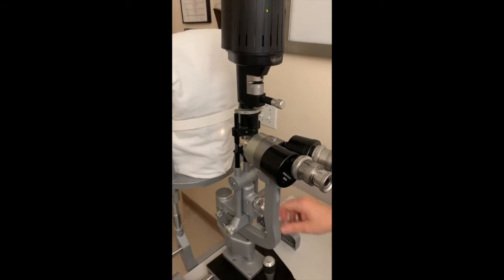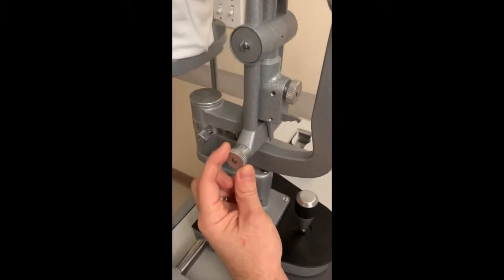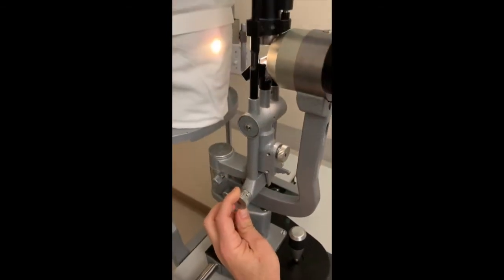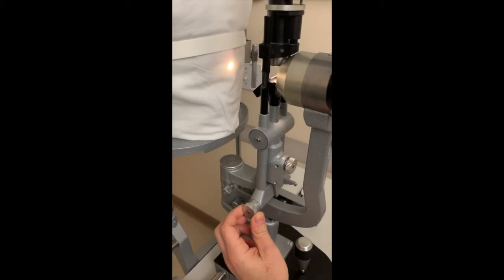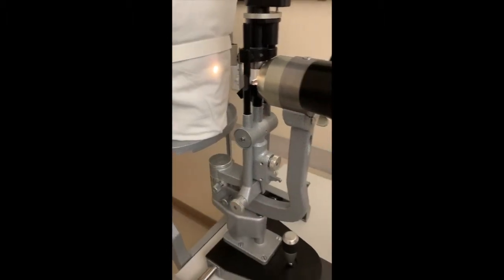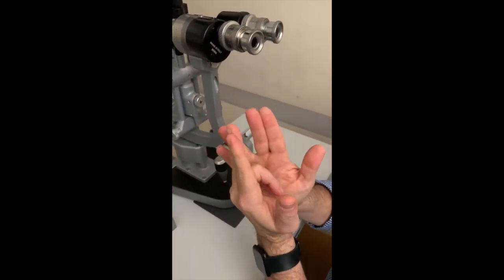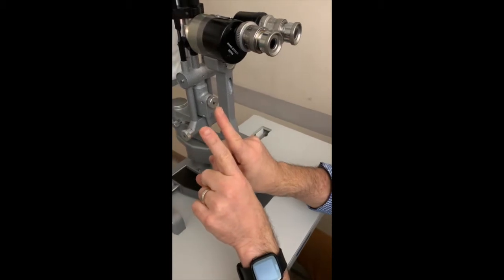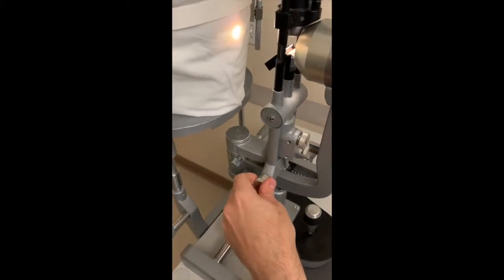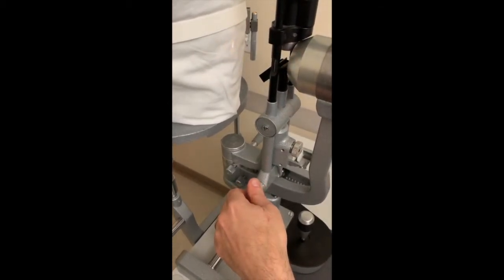Adjust the width using this. And that adjusts the width from almost completely round. So what it's doing really is there's an aperture in there, and as you dial that, you're closing the aperture and decreasing the amount of light that can get through the two slits. So totally open, and then super, super skinny.